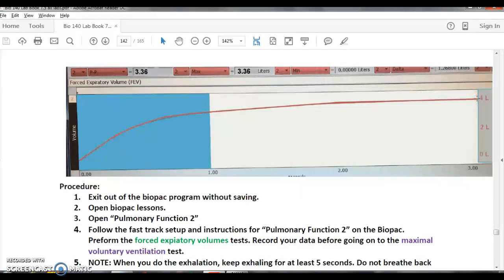Now, this graph is interesting because it tells us how quickly and how fast you are blowing out the air. At 1 second is called the forced expiratory volume at 1 second, and you should be able to blow out 75% to 80% of your forced vital capacity depending on your age. Michael Phelps probably is blowing out 90% of this. If it's under 75%, there is something wrong.